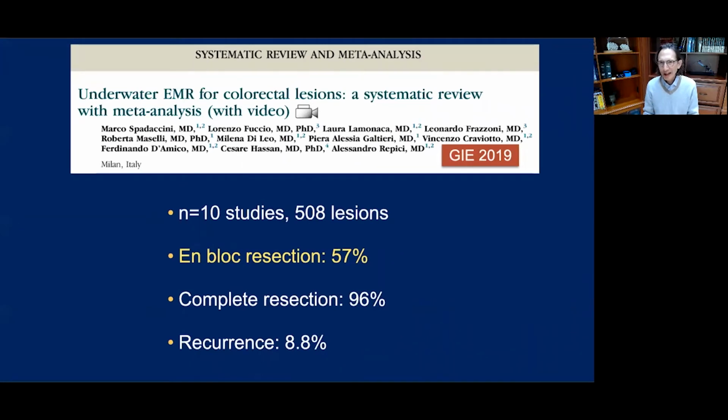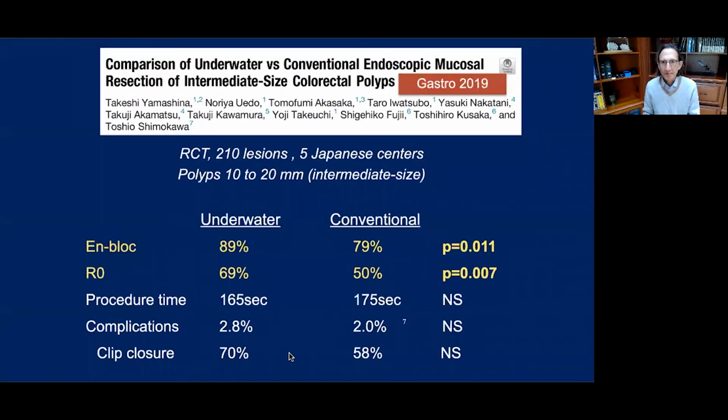Our results were later validated in this meta-analysis of 508 lesions, 10 studies. The en bloc resection rate overall was 57%, the complete resection rate 96%, and the recurrence rate somewhat higher than our 5% at 8.8%, but obviously a very good, very low recurrence rate.